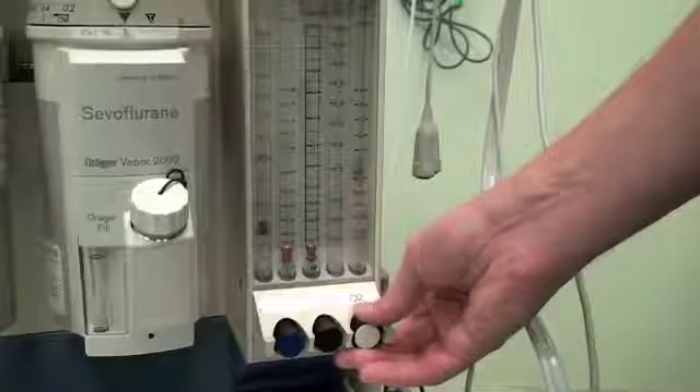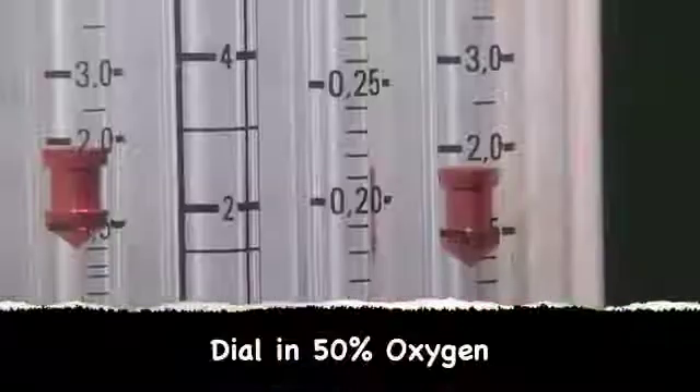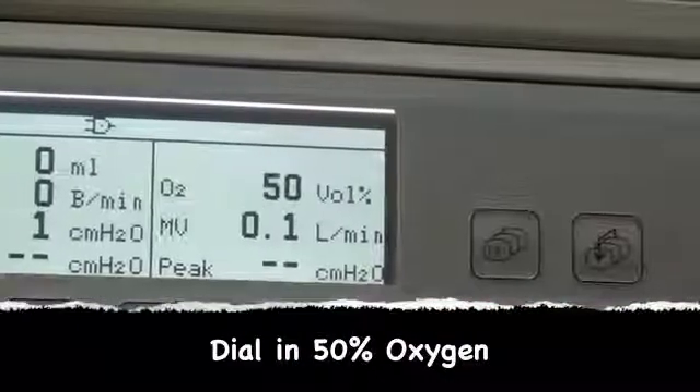The last part of checking the gas supply to the anaesthetic machine is to check that it is actually oxygen being delivered through the oxygen piping. This is done by dialling in a set concentration of oxygen and seeing if the oxygen sensor reads that concentration.